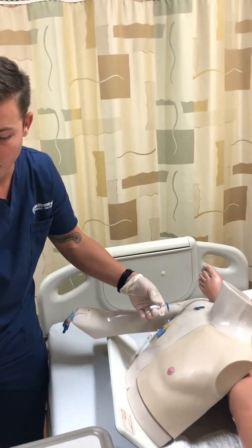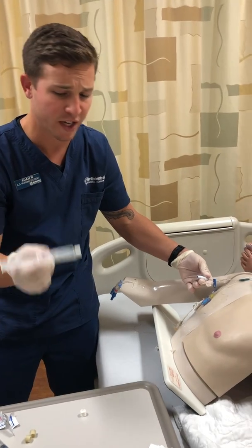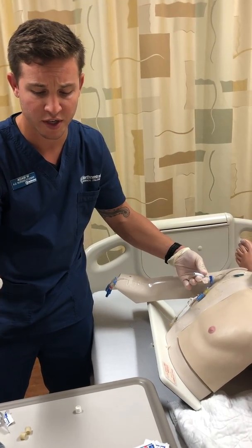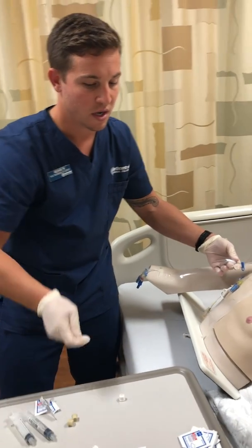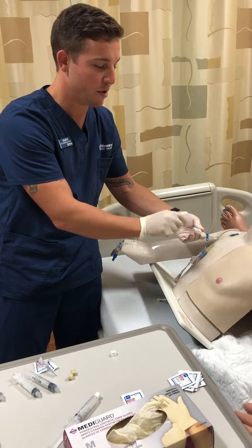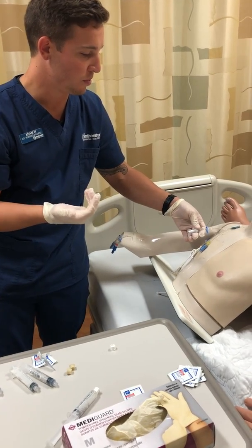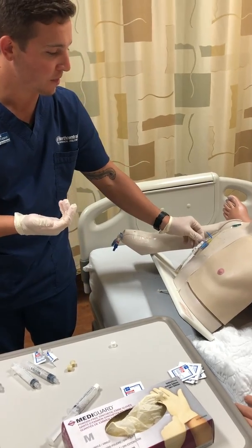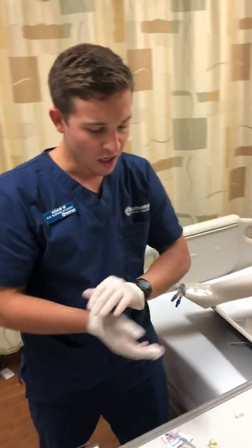And then here, you would put in your heparin. Clean again and put in your heparin here if your facility wants you to do that. Here we actually don't have to use it. Here we would put on that CHG impregnated cap if your facility requires it, which we don't. So there's that. I'll collect all this, and then we will clean up my area.